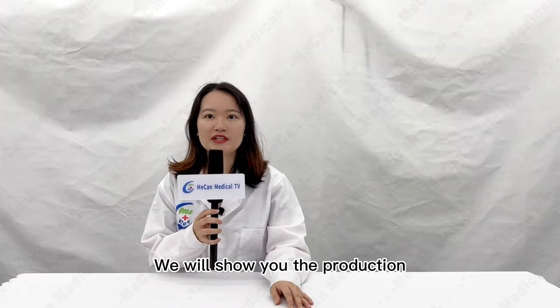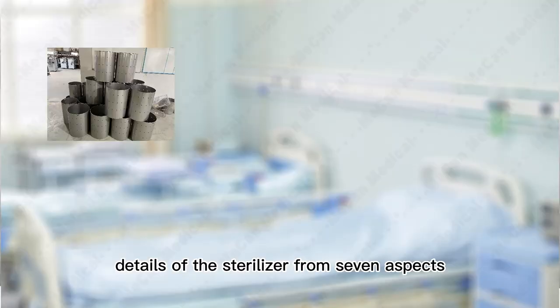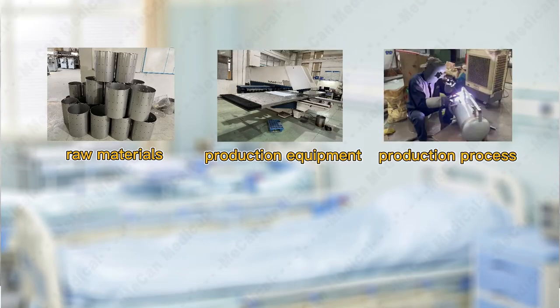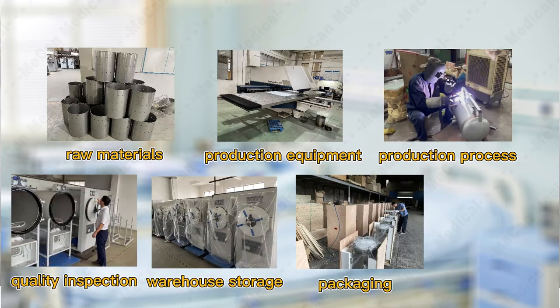We will show you the production details of the sterilizer from seven aspects: raw materials, production equipment, production process, quality inspection, warehouse storage, packaging, and delivery.